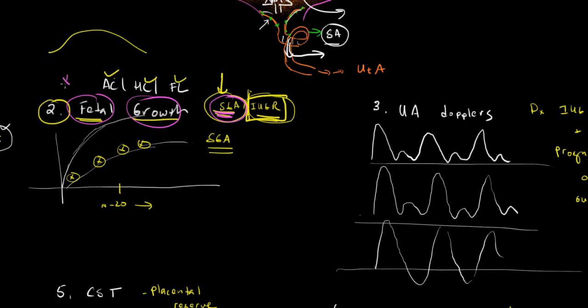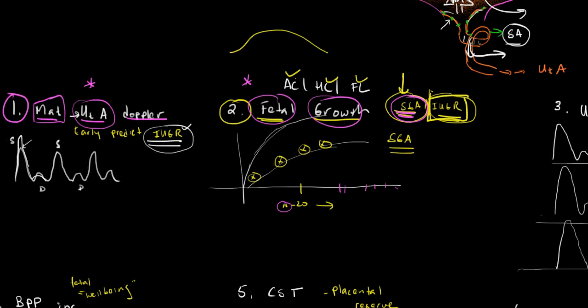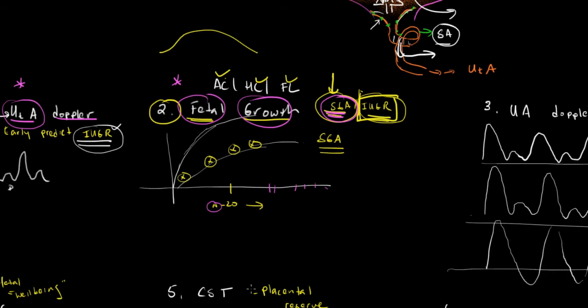And it's accomplished just by a regular routine ultrasound without Dopplers, and you could start doing them around 18 weeks, and then depending on what your concern is, you could do follow-up and plot. So that's the second test measurement that I wanted to talk about. So both of these that we spoke about so far are things that help the doctor find out if the baby has basically chronic growth restriction that's usually due to chronic maternal underperfusion, but it could be due to other things, but it would be things with chronic pathology that impair placental function in a chronic way. They don't cause acute and sudden complete placental dysfunction. They cause a certain amount of imperfection, that the placenta isn't working at full capacity.